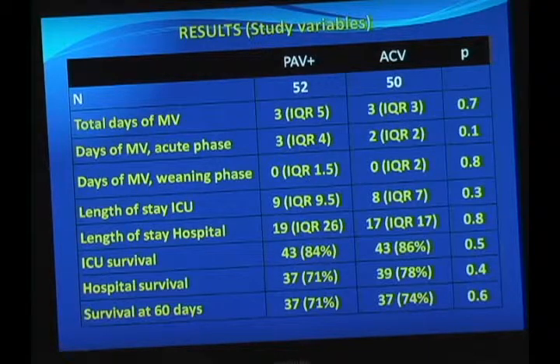And then the other question I had is, do you know how many patients who were on volume control got switched to pressure support after 8, 10, 12 hours? Were they on assist control until they received a spontaneous breathing trial? Yes, our guideline was that. So there was no change in the assist control group, but there could be a change in that.